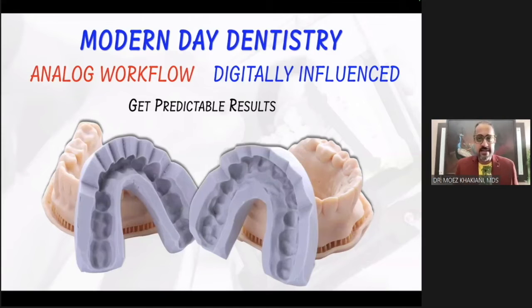I make a putty index. I give the patient a test drive. When I give the patient a test drive, the patient says, oh, wow, doc, I had no idea that this is possible. The patients often get emotional, guys. When they see their own smile, because there's a gratifying change in their smile, they appreciate the work that you do.